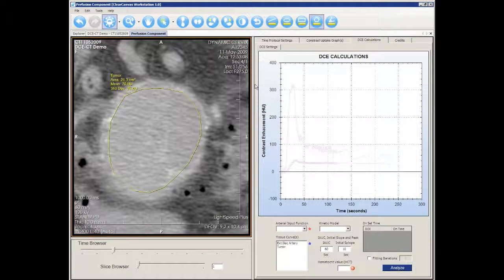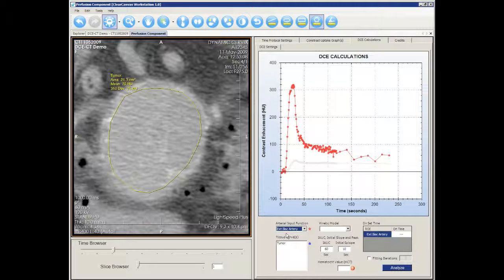Select the external iliac artery for the arterial input function. Then select the tumor for analysis. We can analyze more than one tissue region of interest if needed.